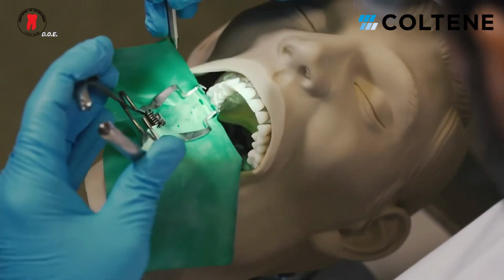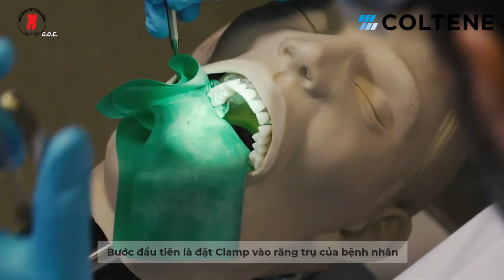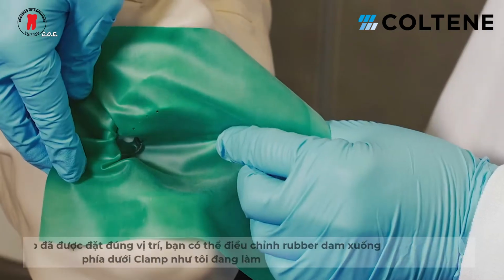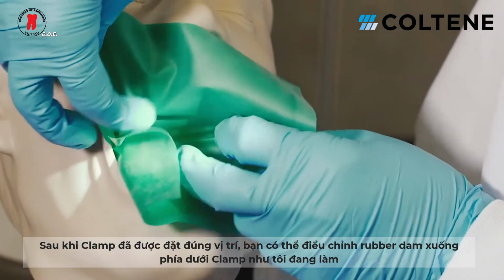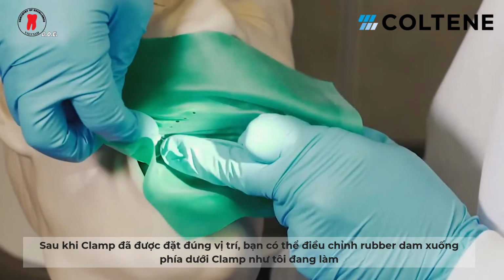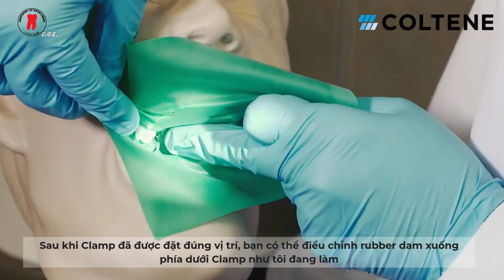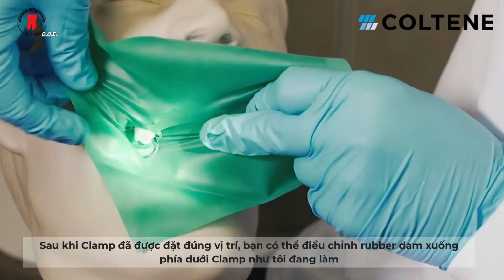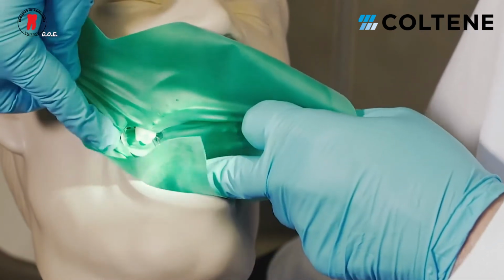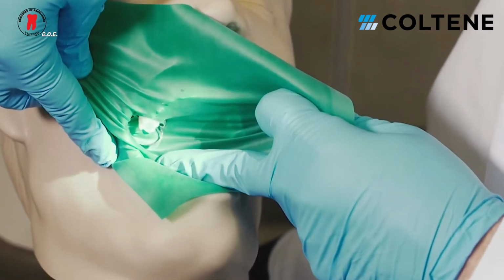So our first step is going to be to attach this W3 clamp to our abutment tooth. Once the clamp has been seated on the abutment tooth, the next step is going to be making sure that you can release the rubber dam and place the rubber dam underneath the jaws of the clamp, just like we did right now. So now you're able to see the jaws of the clamp in the patient's mouth, surrounding the tooth and the rubber dam underneath the jaws.